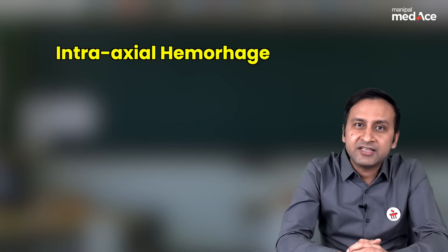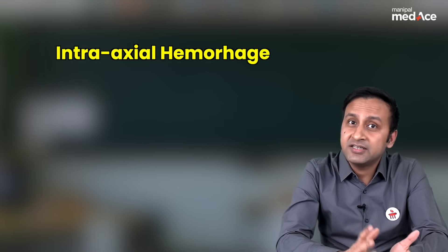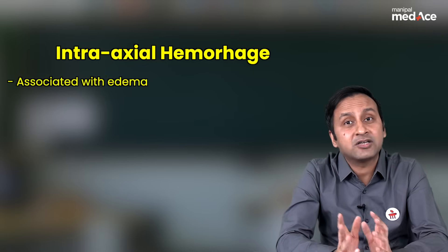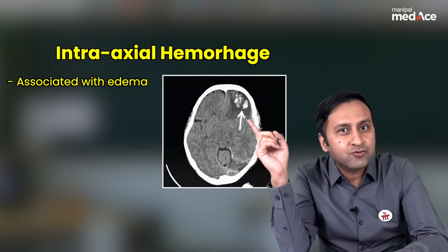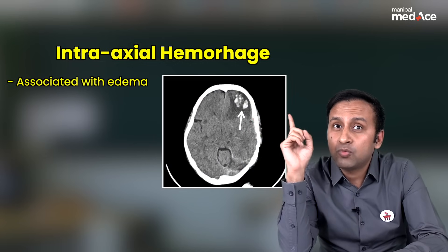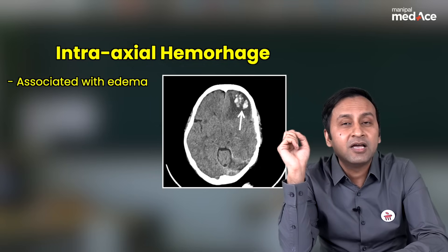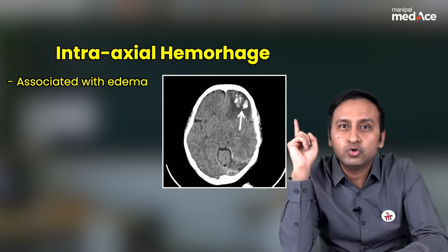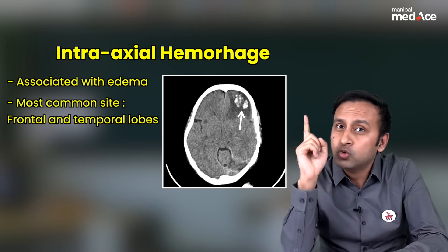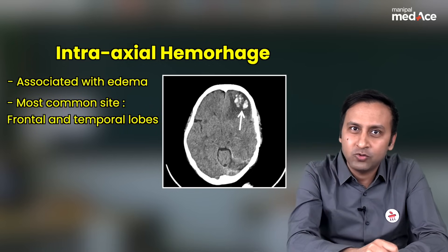Let's talk about the intraaxial bleeds. Intraaxial bleeds are the ones which occur inside the brain parenchyma and are associated with edema. In this case, you can see there are multiple small bleeds in the frontal lobe which are associated with perifocal edema. This is a classical example of contusions, and the most common site of contusions is the frontal and temporal lobes.